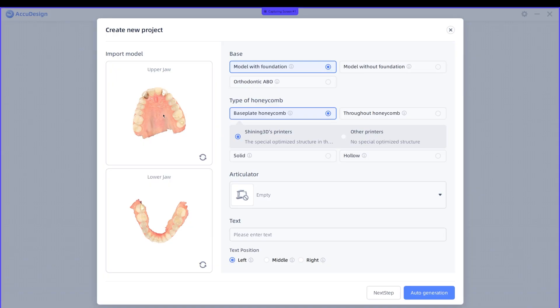I'm going to make a model of both. I want a model with a foundation. You can see the orthodontic is a slightly different foundation. I'm going to do a baseplate honeycomb — this will get you the best results for your model.